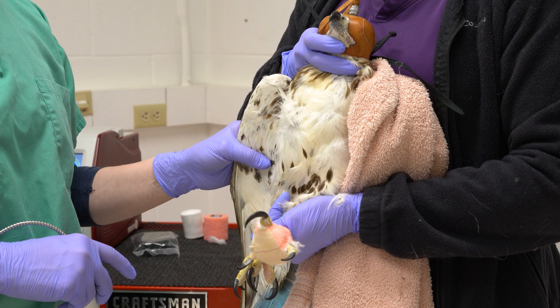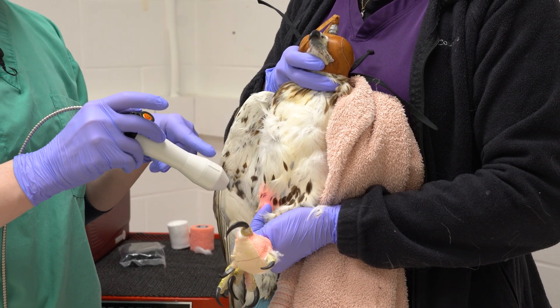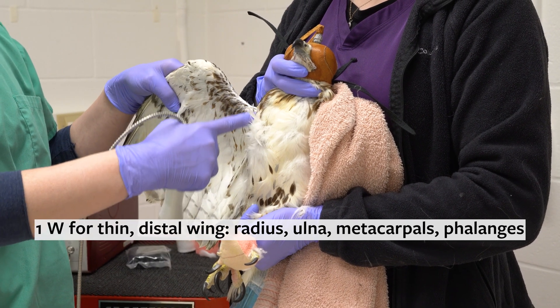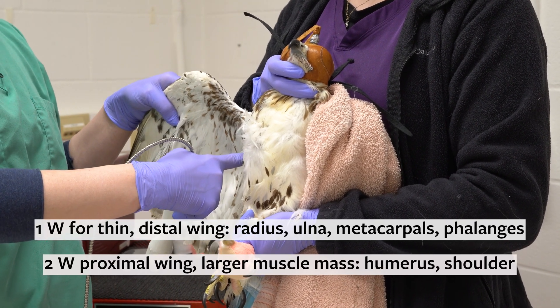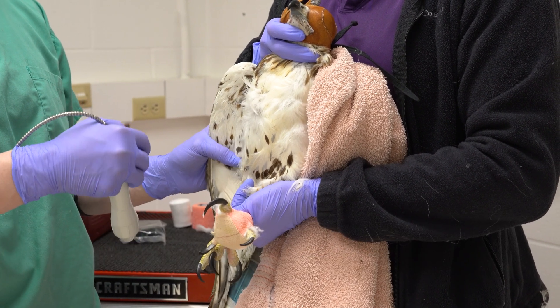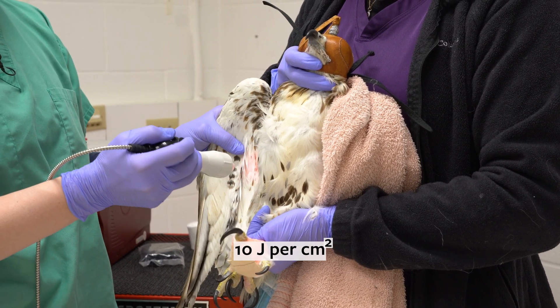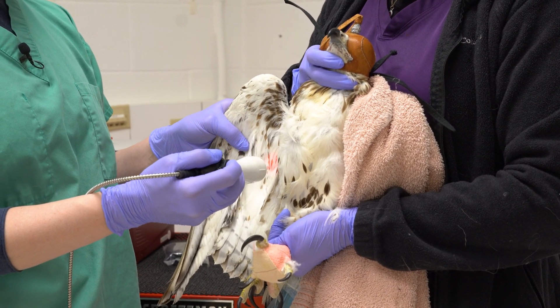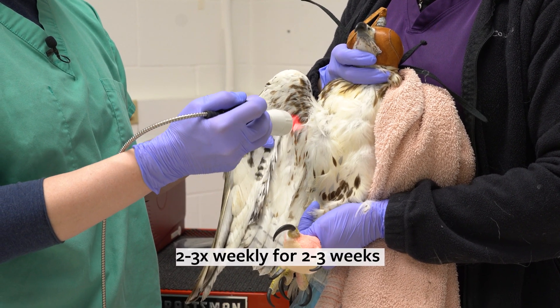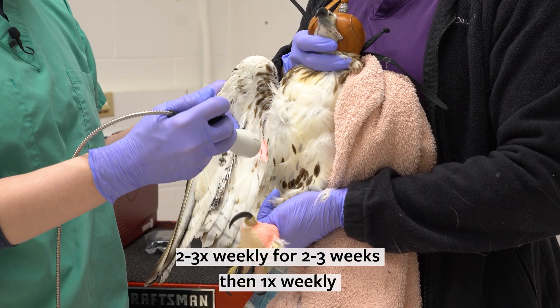For the combination of soft tissue injury and fracture repair, I use a small non-touch probe set at one watt for the thin distal wing including the radius, ulna, metacarpals, and phalanges, and 2 watts for the proximal wing of larger birds with larger amounts of muscle mass such as the humerus and shoulder. The dosage should be around 10 joules per centimeter squared, with the laser continuously moving over the affected tissue held about 3 to 5 centimeters from the skin. This therapy can be repeated 2 to 3 times weekly for the first 2 to 3 weeks post-operatively, then once weekly after that to support continued healing.